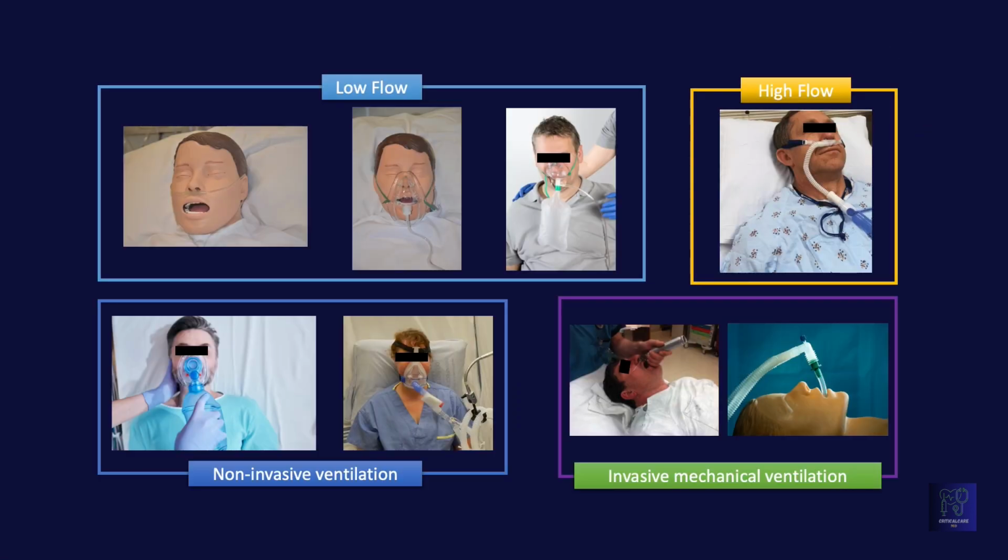There are various options to provide supplemental oxygen. Which one of these devices will you pick to provide supplemental oxygen to the patient we just discussed? If you are not very sure, do follow along and we will discuss the answer towards the end of this video.